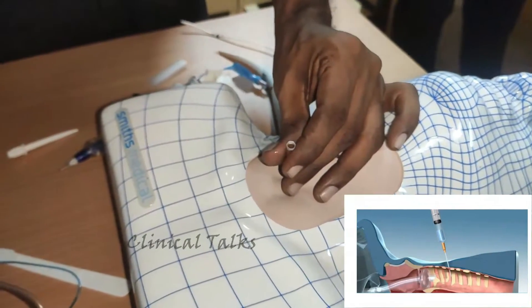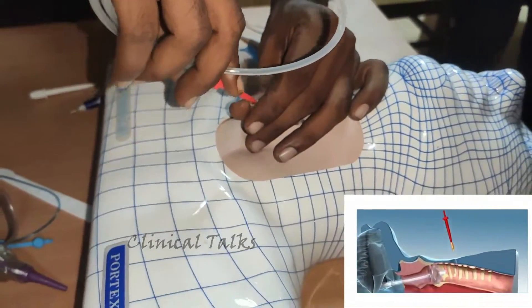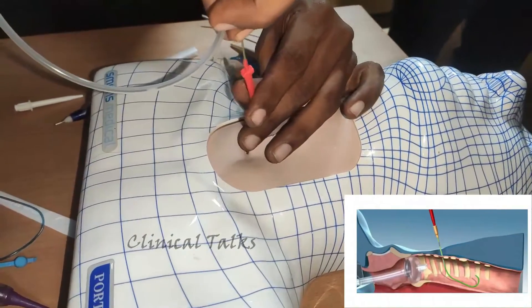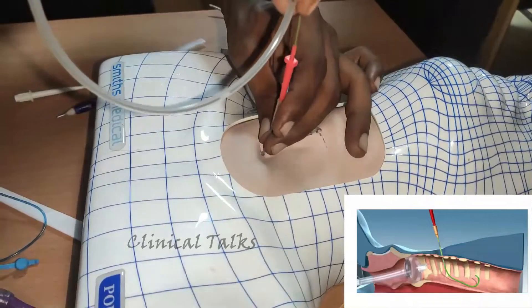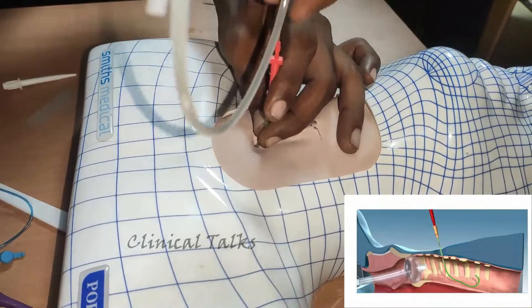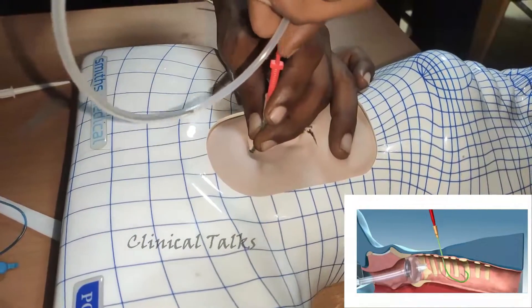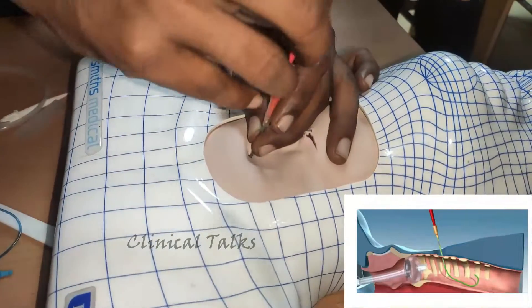Remove the syringe. Step 3. Next, take the flexible guide wire and guide wire introducer and straighten the J-tip using the guide wire introducer. Insert the guide wire introducer into the plastic cannula and advance the guide wire until the first mark can be seen in the cannula and at the level of the skin. Great care should be taken throughout the procedure to avoid kinking the guide wire. Confirm free movement of the guide wire by moving the guide wire, without resistance, in and out of the cannula prior to removal.